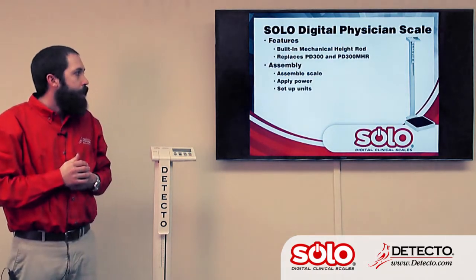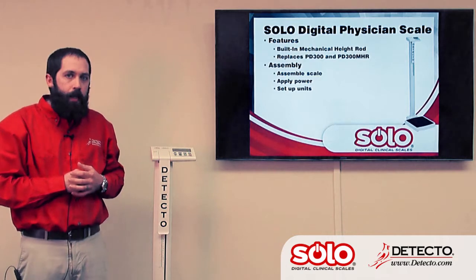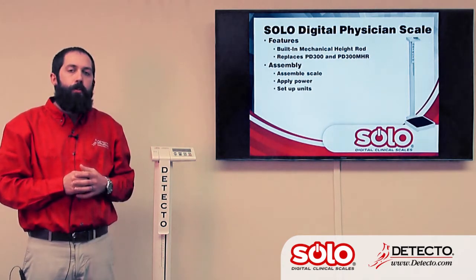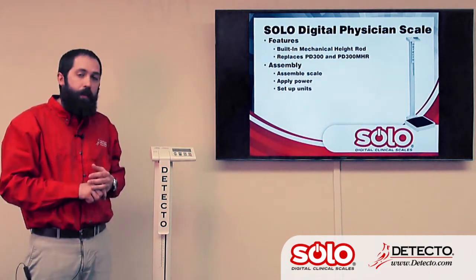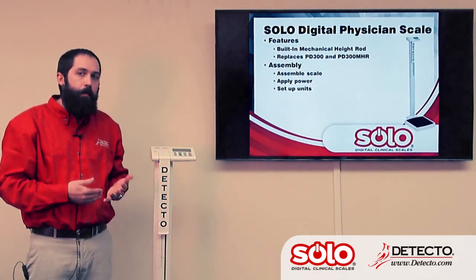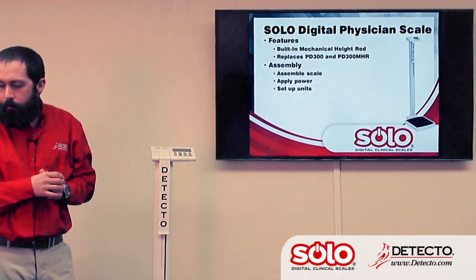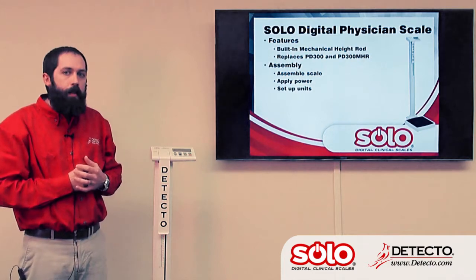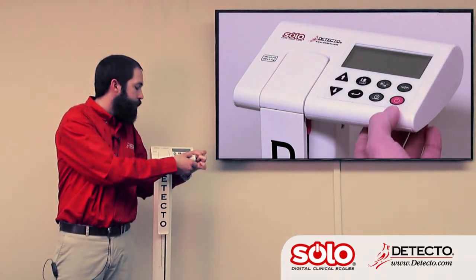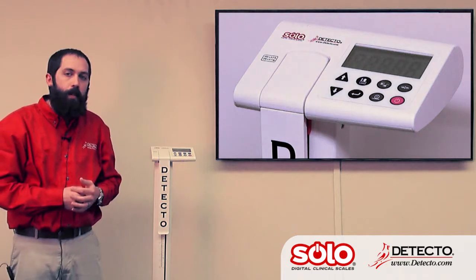The Solo is powered by either AA batteries, which are installed behind the display, or a 9-volt DC power supply. When starting this scale for the first time, you'll be prompted to select units — either pounds or kilograms. This is a feature we're also going to see in the Apex and Icon scales. To get into the basic non-weight settings setup, hold down the zero key, turn the scale on, and it comes up and prompts you to enter the time. You can then cycle through the different time and date settings, plus a few other settings as well.